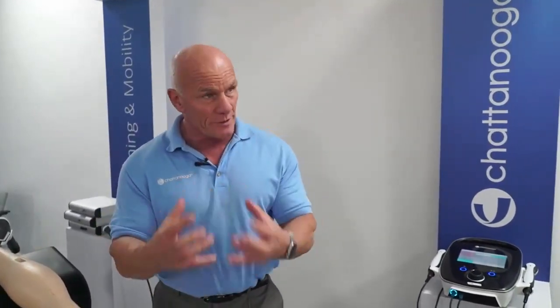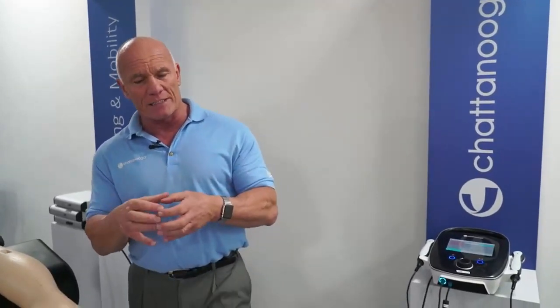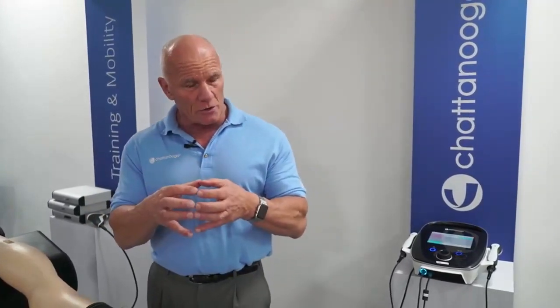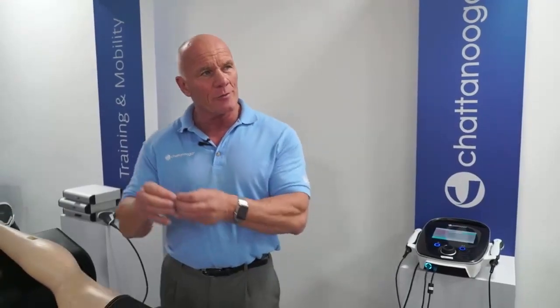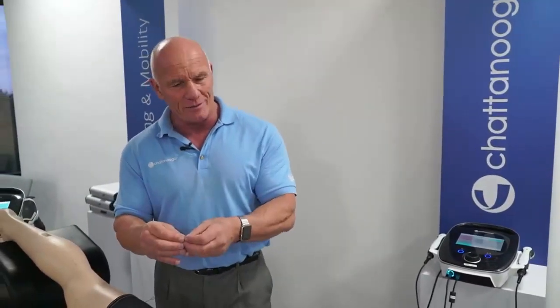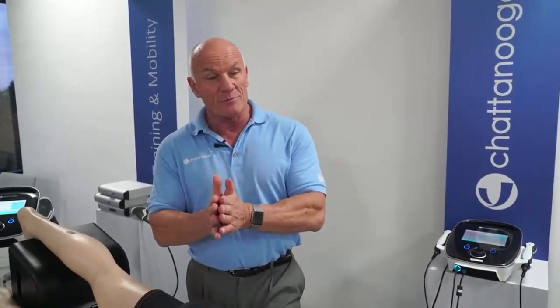Now, Schmitz et al. said at the time of publication, the optimal protocol appeared to be 2,000 shocks administered once a week at the maximum tolerable intensity. Now, that's obviously going to vary from patient to patient. So I found, from my experience, maximum tolerable intensity ranges between 4 and 5 bar on the Chattanooga machine.